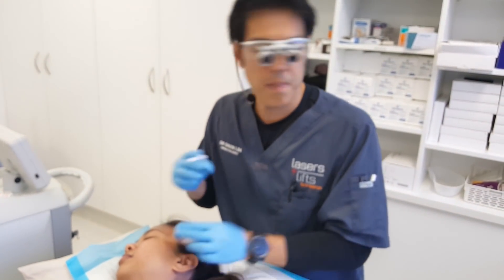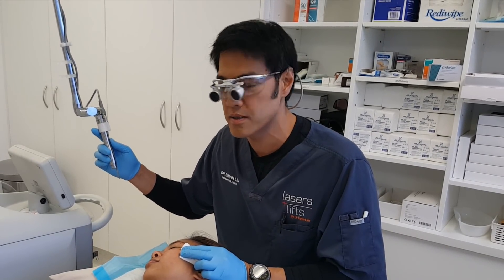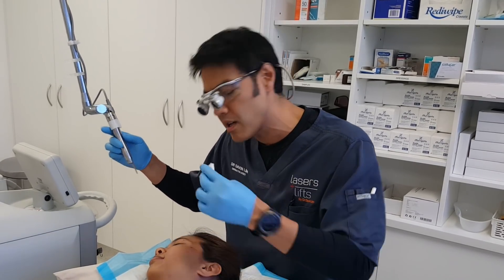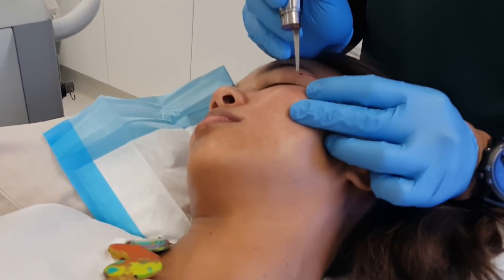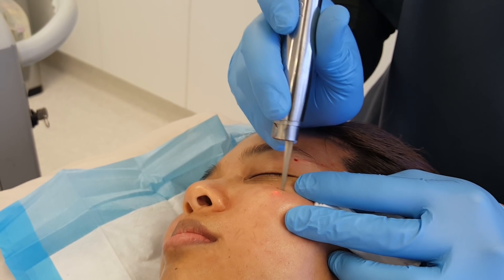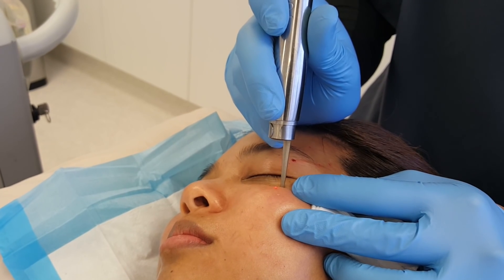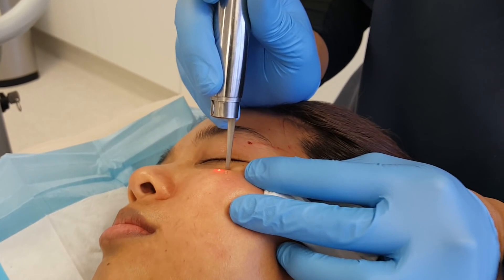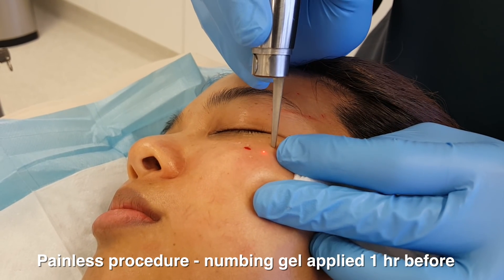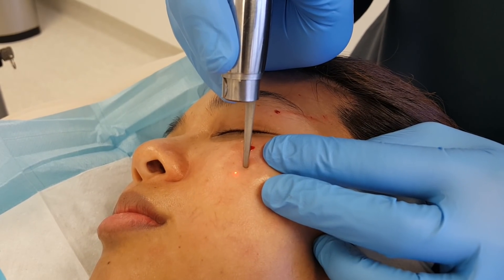Now we'll swap over to a laser. I'm using an erbium laser with a one-millimeter spot size — I like it because it's more accurate, and I prefer it over CO2, especially in Asian skin types. For the really small ones I have trouble with the curette, the laser is just a hit — bang, gone. You can see how quickly the laser works, and even the tiniest ones can be treated with absolute laser accuracy.